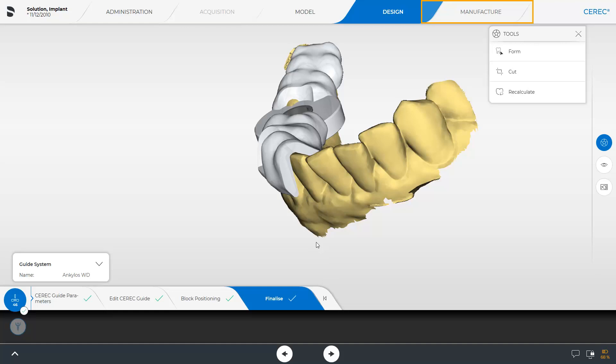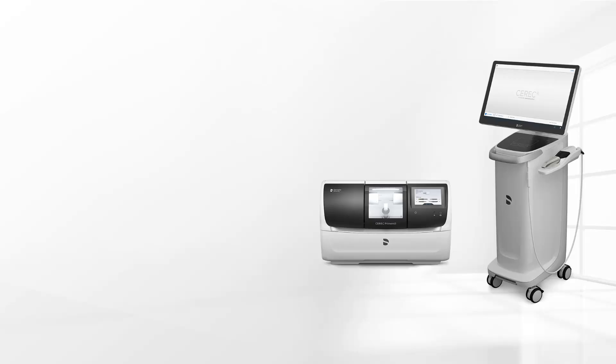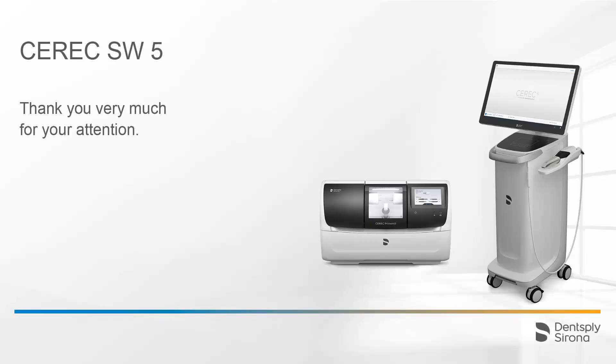We will not cover the Manufacture phase in this tutorial. For detailed information covering the workflow starting with the implant planning up to the Manufacture phase, you can view our tutorial series on the topic of Digital Chairside Implant Workflow. Thank you very much for your attention. We would like to wish you every success when working with CEREC.